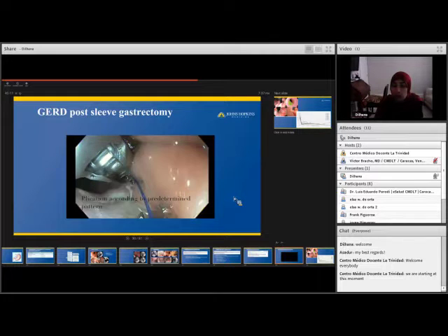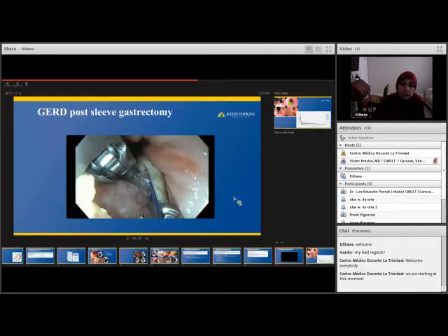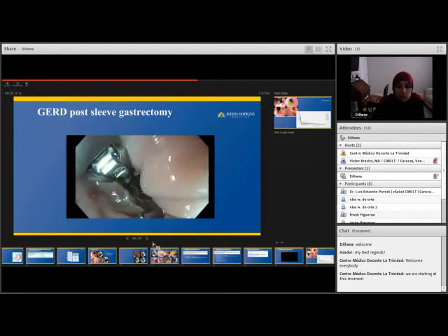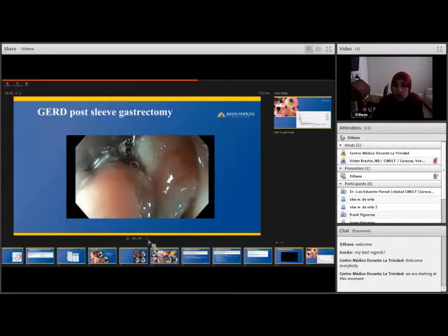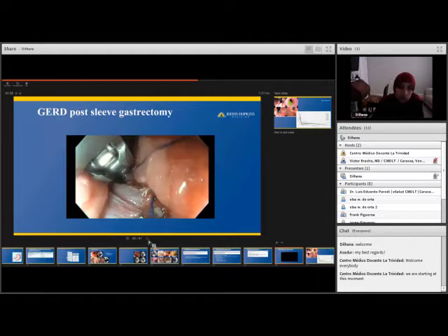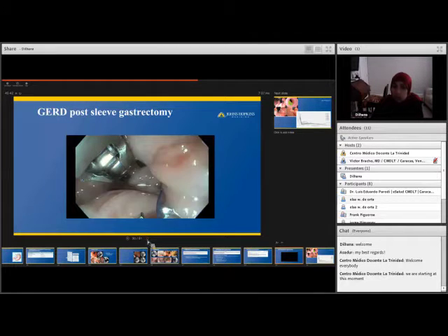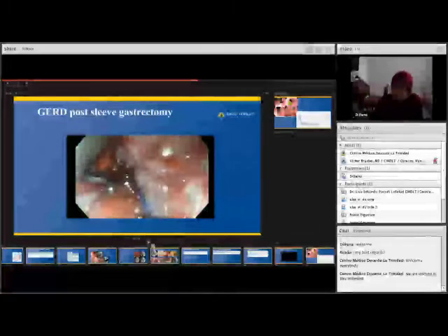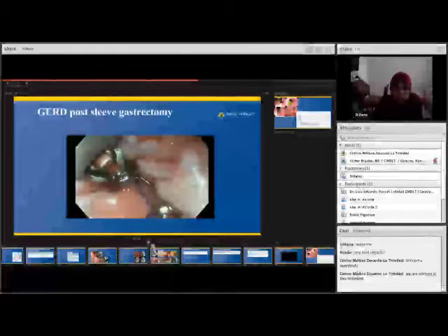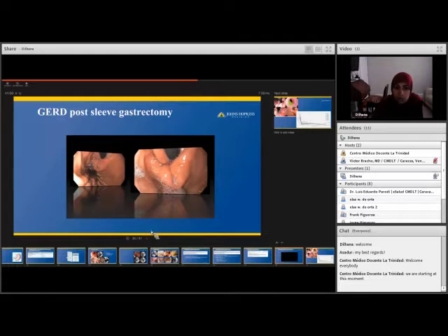Now in retroflexion, they're completing the mucosal resection with a snare, and you can see here, so very nicely done. And then what they do is they use endoscopic suturing, but in a specific pattern. And then they pull down on those sutures in order to tighten or basically create a lower esophageal sphincter in these patients. So this is a simple procedure using technology that is already in existence, and it's not something that has to be learned. Most therapeutic endoscopists know how to do endoscopic submucosal dissection as well as suturing. So something that can be done by most therapeutic endoscopists or bariatric endoscopists.